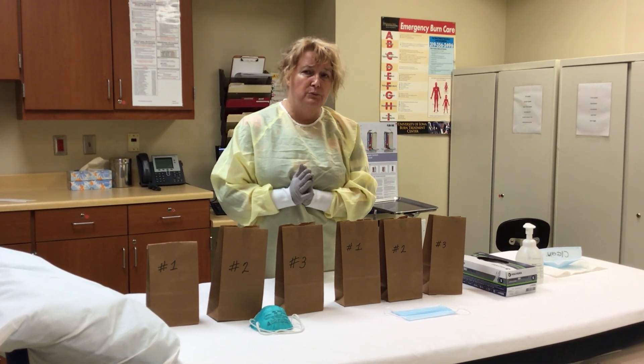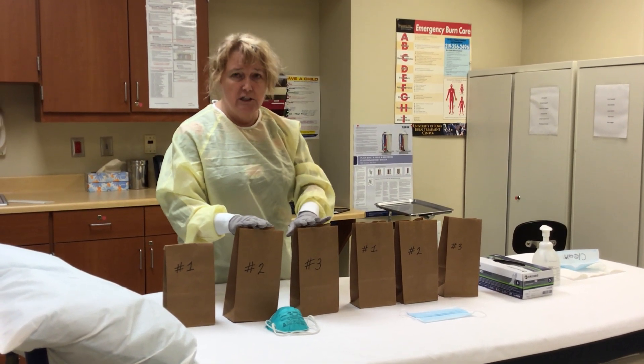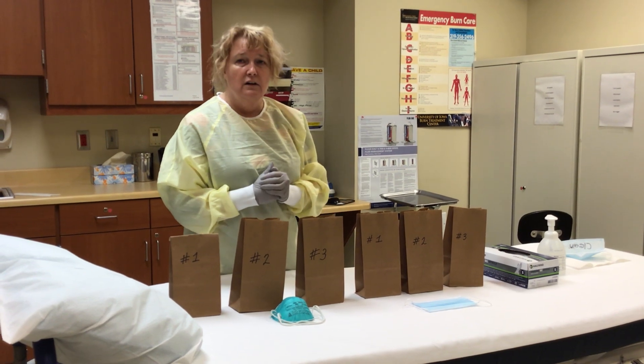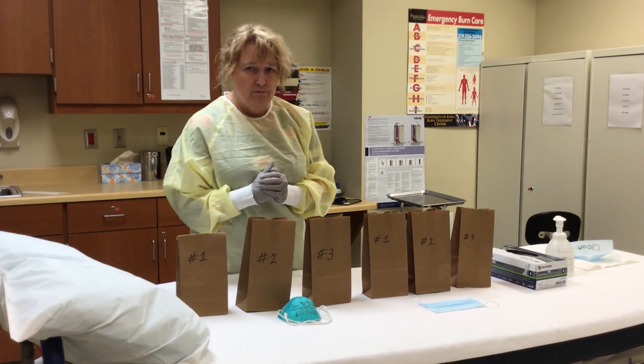And there we have it — proper way to put masks on, proper way to take them off, proper way to allow your mask to decontaminate for that 48 hours. Again, if you do not have three masks at least of each kind, then you need to speak with your leaders. Thank you.